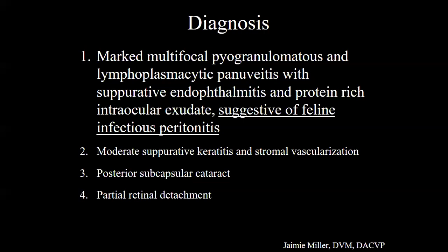So the comment was that in a lot of other organ systems in cats with FIP, the main histologic lesion is a vasculitis, where the inflammation is focused, and we don't always catch that in the globes, almost never, very rarely, if at all. But the other comment was that the uvea is a very highly vascular tissue, so maybe we just can't tell that the vasculitis is there.